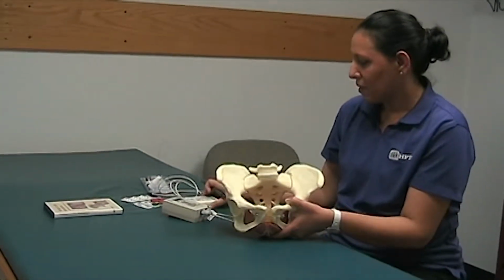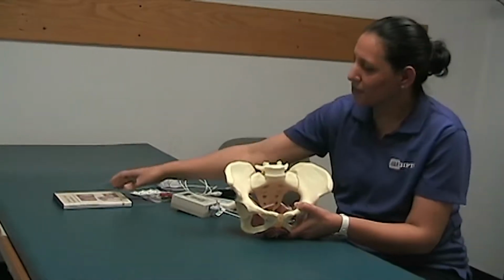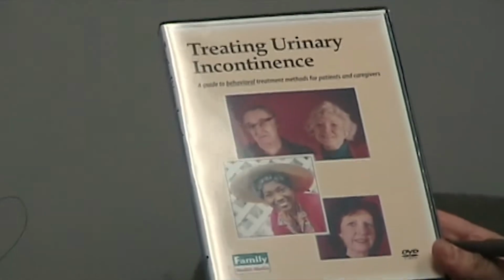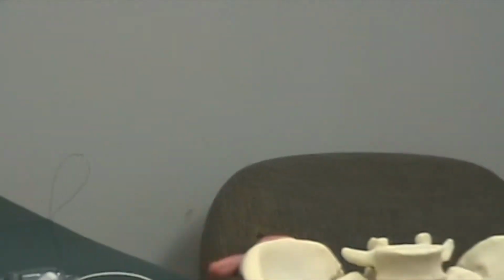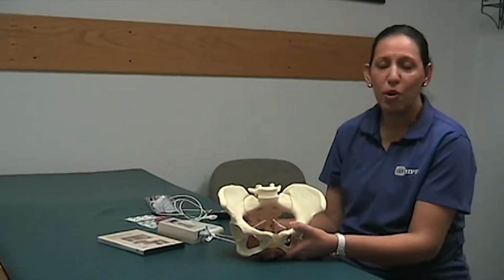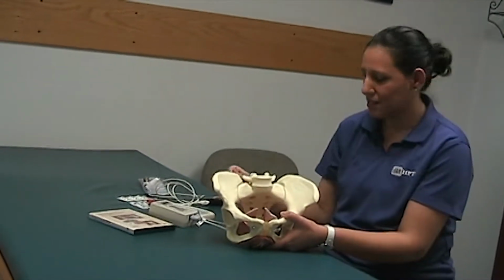Now, in addition to that, we can also give the patients homework to do, and they can use this E-stim unit at home to strengthen their pelvic floor muscles. In addition to that, we also have this incontinence video that we use to educate the patients on the different types of incontinence and to work on behavioral modifications that they can use at home in order to see what they're doing at home. We also teach them home exercise programs. We teach them about how to monitor themselves during the day and how to encounter accidents when they happen and what they can do about those accidents.